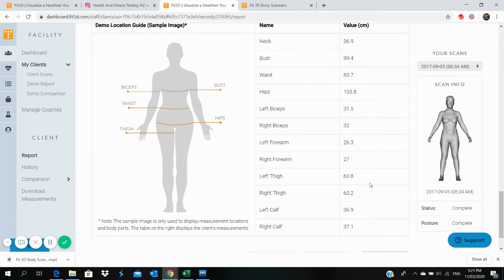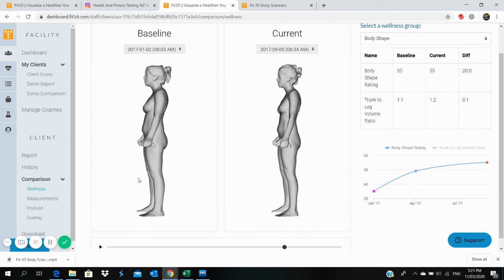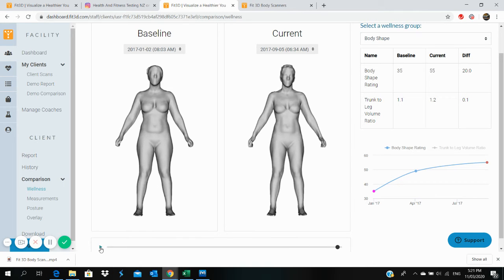Now it gets a lot more interesting when you start comparing scans over time. So if you want to do a scan before an intervention and after, here's what you'll see. You just click on comparison mode and it can compare 2 images over time. On the screen right now, you'll see that this person, their bottom slightly different on their left compared to their right. You'll see the stomach slightly larger on the left compared to the right. You can twist this image around in all directions. So you can look at front on, which you'll see that the V angle around the waist is slightly different on the left and the right. The breast is slightly bigger on the left compared to the right as well.